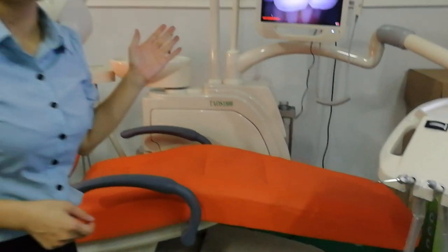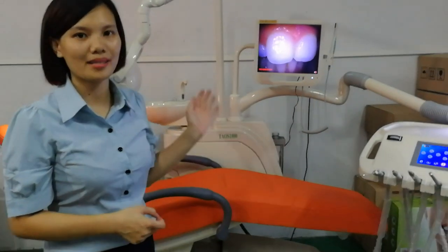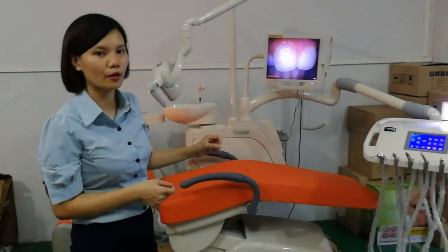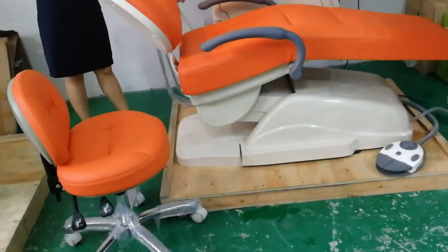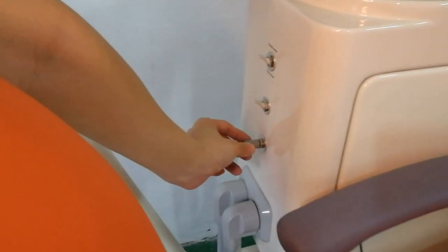We have another very unique function on this chair: a vacuum cleaning tube system. It will push the debris or solids from the drainage tube and remove bad smells from the clinic. You just open it from this switch before the dentist leaves the clinic — just open it for 2 minutes.